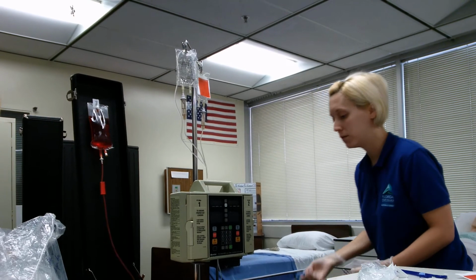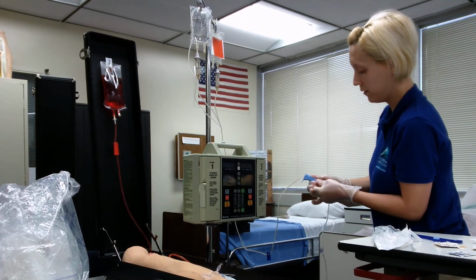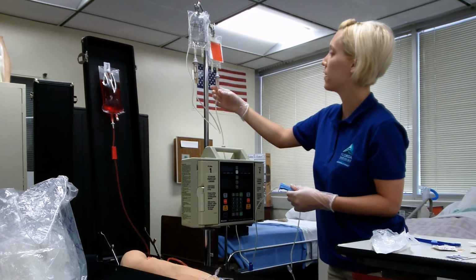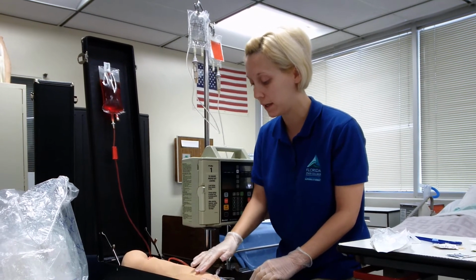This would have been unclamped. Make sure it's unclamped again. I'm going to make sure that that is running still at 17 drops per minute. I'm going to come over here and check my site again for any phlebitis.